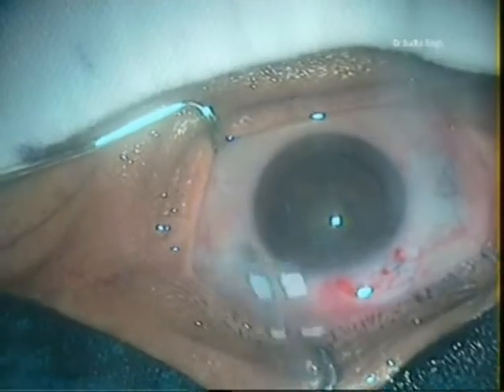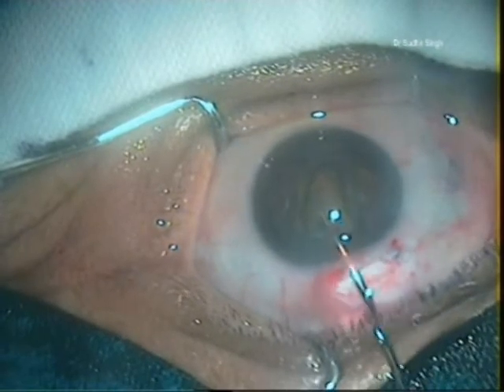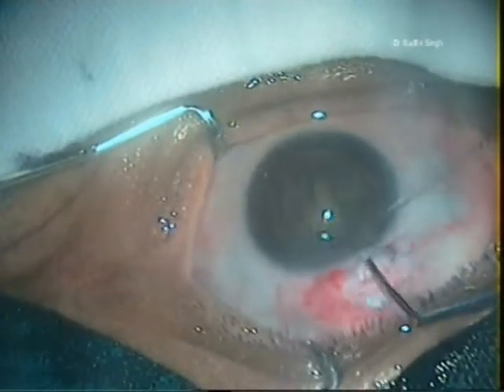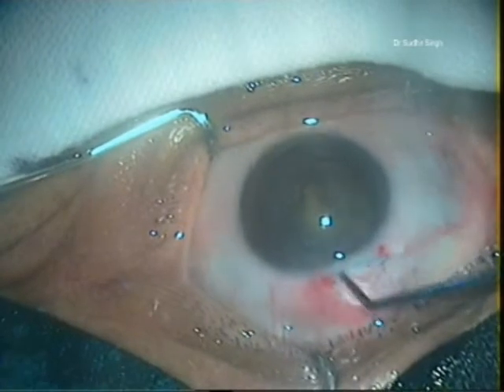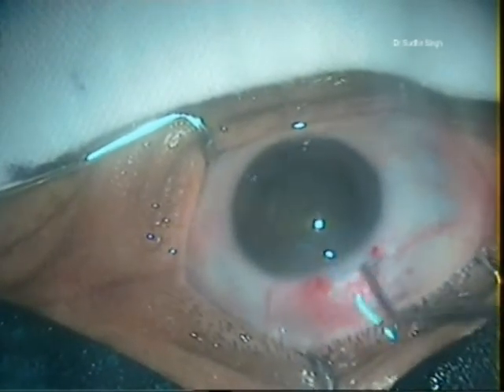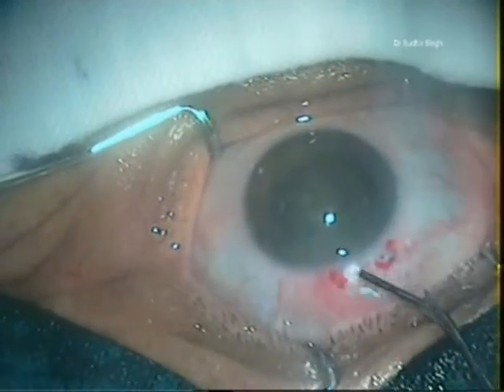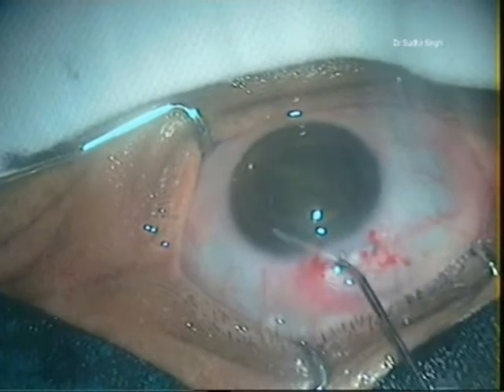The nucleus is prolapsed into the anterior chamber with the MSICS hook. Enough viscoelastic is placed between the cornea and the superior surface of the nucleus, and between the inferior surface of the nucleus and iris. The globe is stabilized with tooth forceps and the vectis is introduced through the tunnel and positioned between the iris and the nucleus.